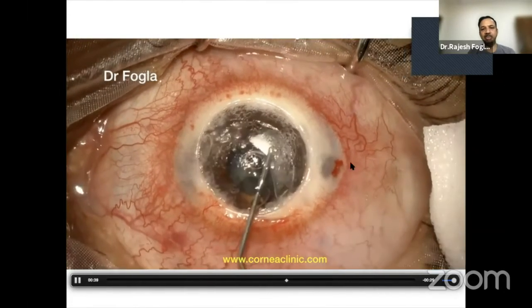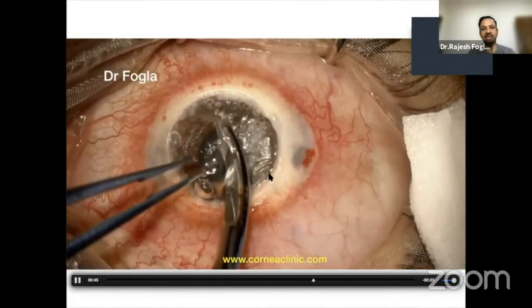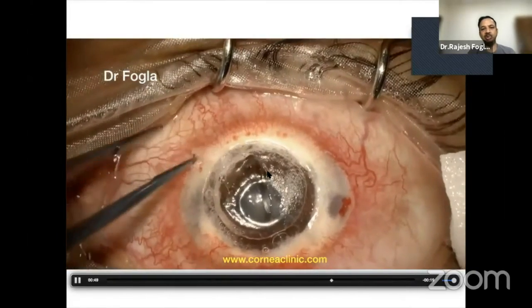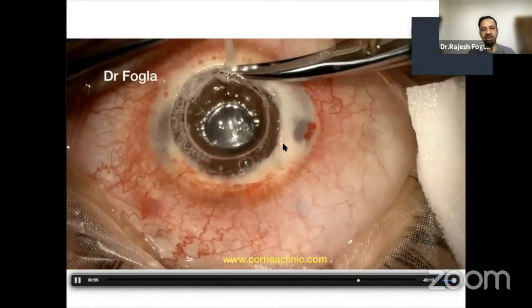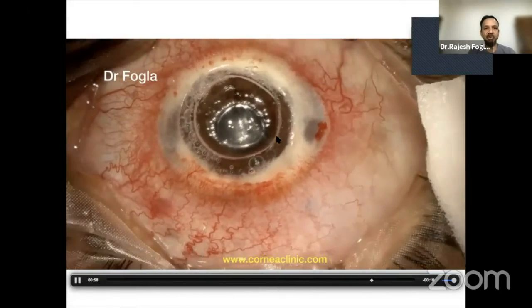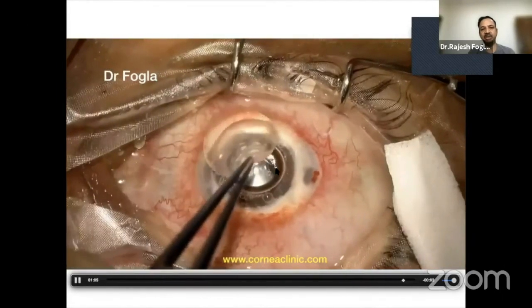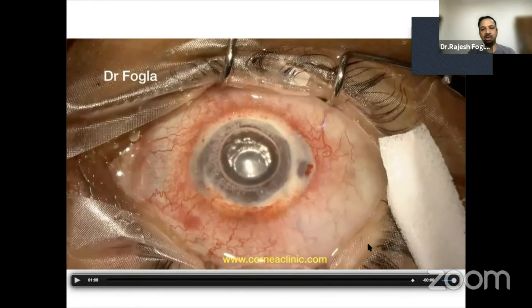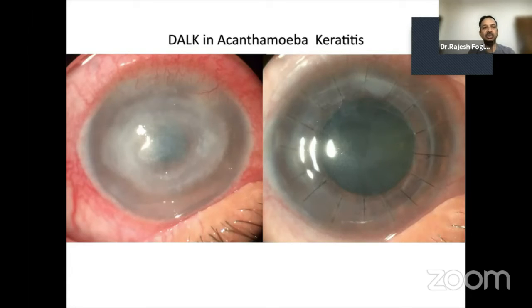We released the speculum, made the eye very soft, and injected some cohesive viscoelastic, knowing that with a type 2 bubble the Descemet's membrane is very fragile and can easily rupture. We were able to maintain the intact Descemet's membrane, complete the removal of the anterior stroma, and then place a graft and secure it. When de-roofing a type 2 bubble, you must ensure minimal upthrust, repeatedly release aqueous to keep the eye soft, and make sure your instrument does not contact the Descemet's membrane. This patient had a good visual outcome, but medical therapy must be continued post-operatively because residual infection can remain, and without anti-amoebic therapy the chances of recurrence can be high.